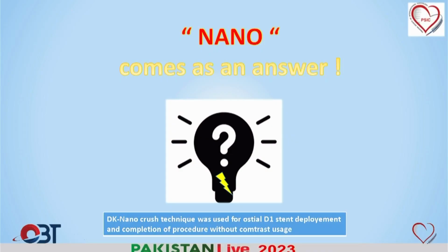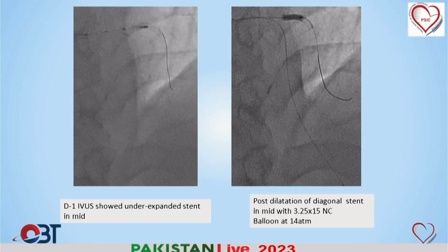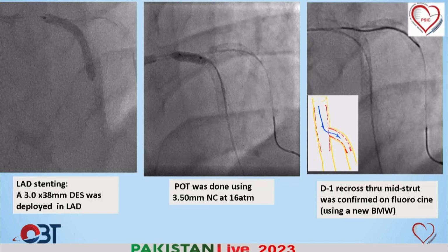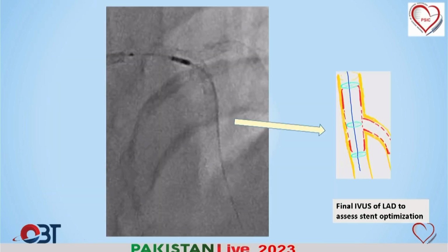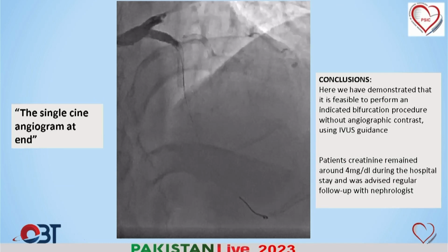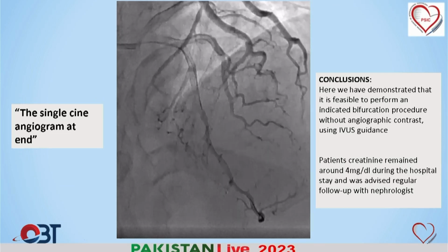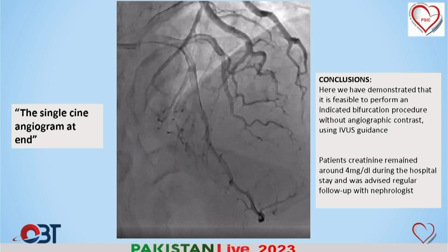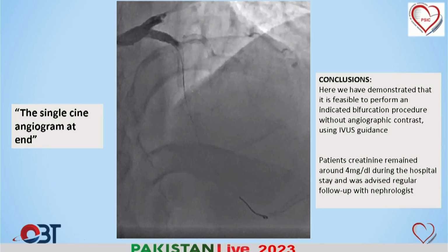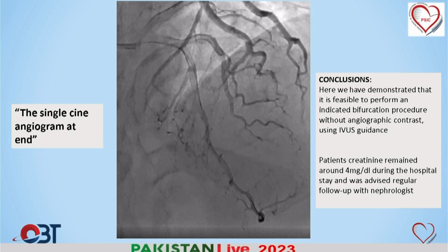The last view. So you see after in the last view, the diagonal is a huge vessel. The diameter is huge, the length is huge, the IVUS shows a diameter of 3.2. Usually, even when we are proceeding normally in most of our patients, if a vessel is like 3 point something in diameter, doing only a POBA to that is usually less of a practice.